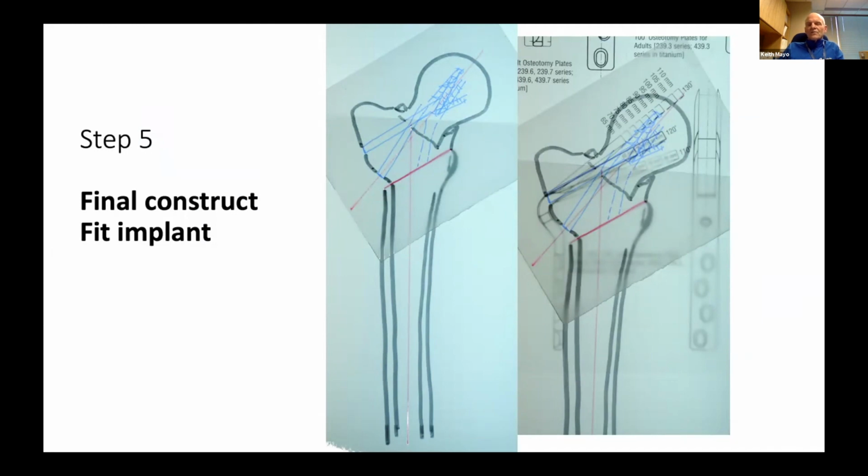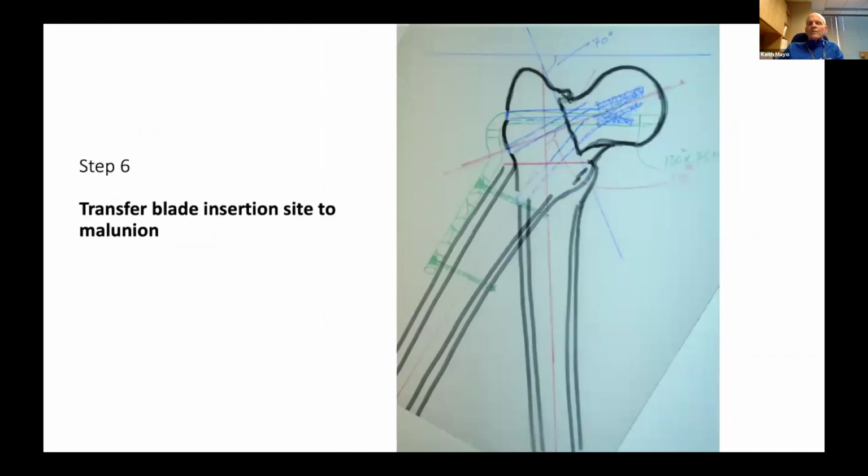And in most cases, you're better off now taking the drawing on the right and superimposing the proximal femur on your deformity drawing. So this will give you your seating chisel path. In situations in which you have an easy correction, as we've set up here, which was a 30-degree frontal plane correction, then with a 120-degree blade plate, your seating chisel will go in perpendicular to the long axis of the femur, but it's always best to check this position on your original drawing.